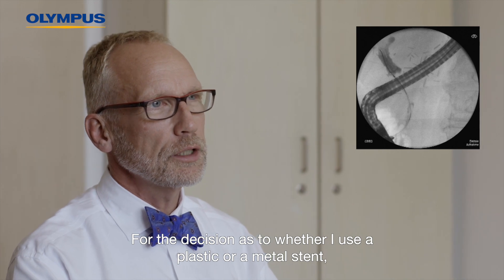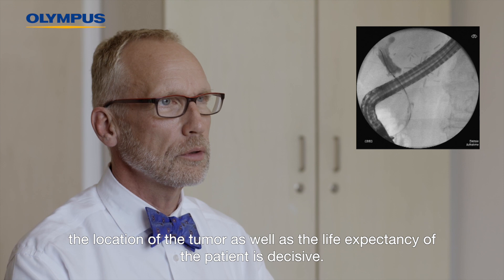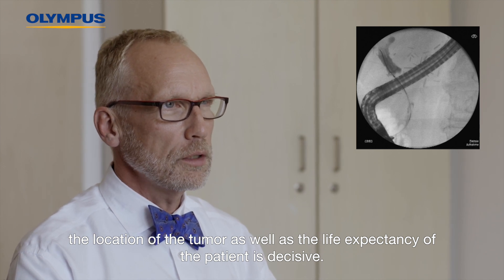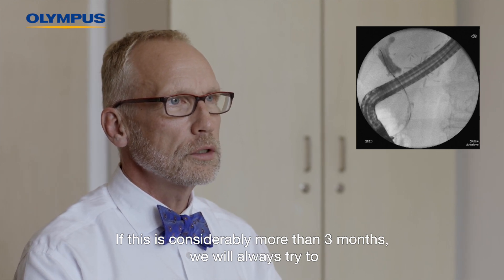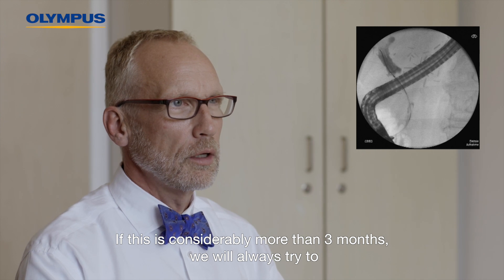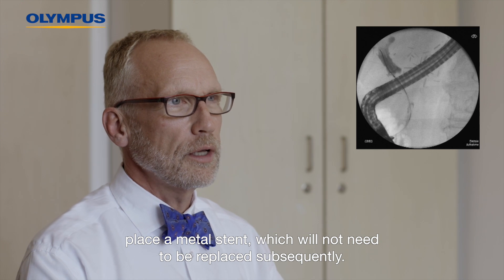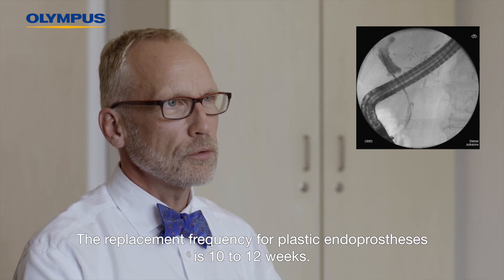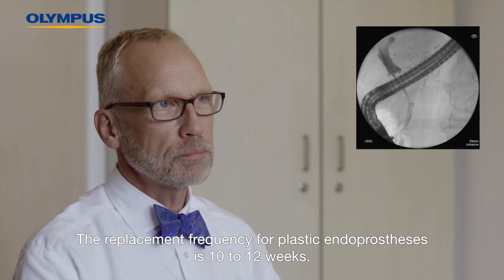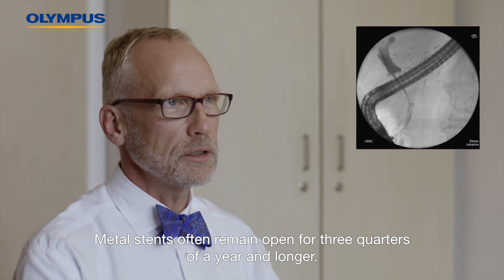For the decision as to whether to use a plastic or a metal stent, the location of the tumour as well as the life expectancy of the patient is decisive. If this is considerably more than three months, we will always try to place a metal stent, which will not need to be replaced subsequently. The replacement frequency for plastic endoprosthesis is 10 to 12 weeks, while metal stents often remain open for three-quarters of a year and longer.